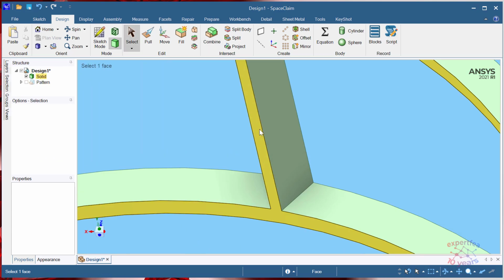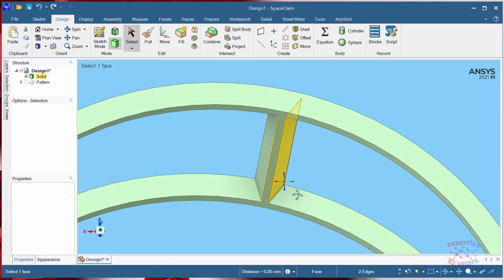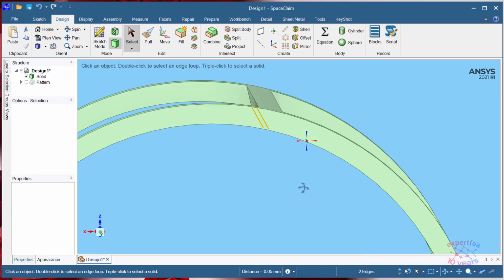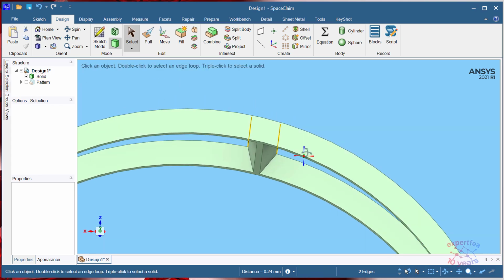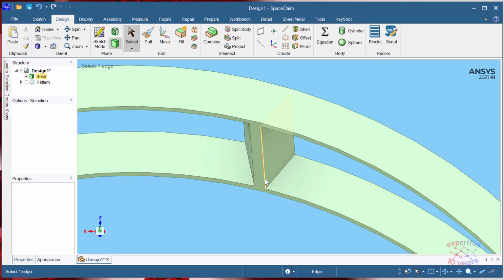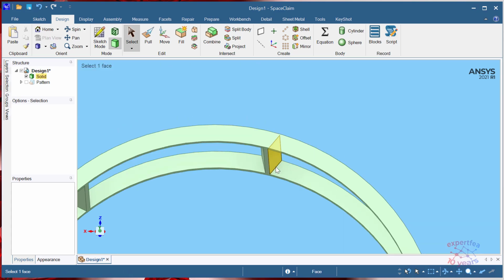So here we have much smaller thickness. Instead it's kind of too small. Let's see this one, 0.24. I'm satisfied with this one. Let's increase here, yeah, instead of 0.05 let's make it, yeah, let's move a little.